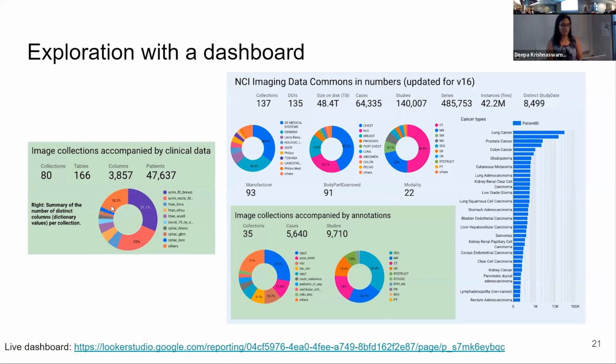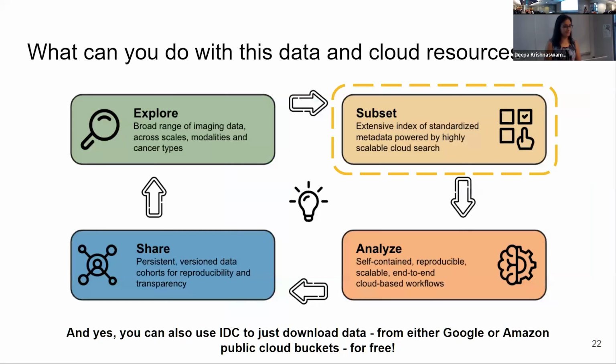And also you can explore this data using a dashboard. This is also part of the Google Cloud Platform, which is what IDC uses. And here you can search by different modalities or manufacturers. And so hopefully all of these can help you actually form the cohort that you want and are interested in.